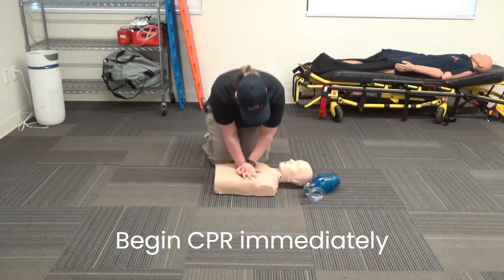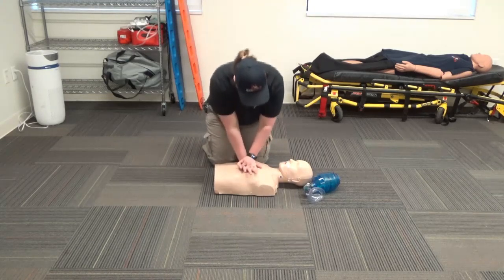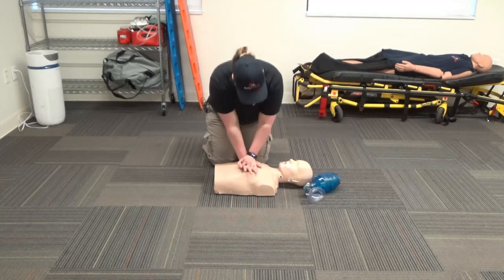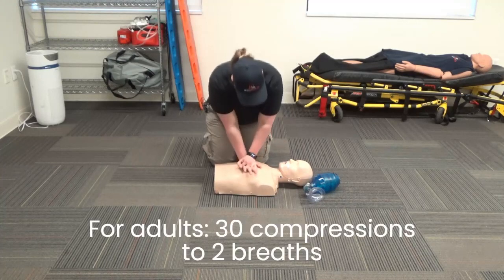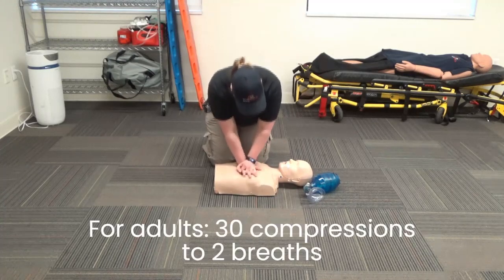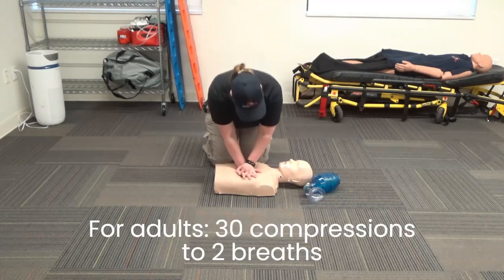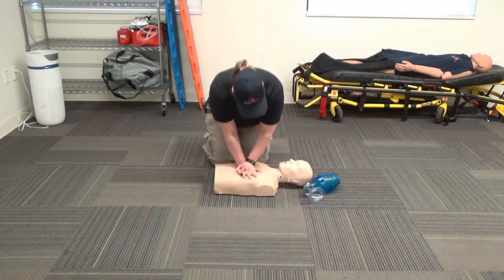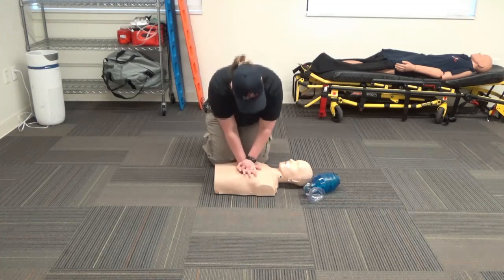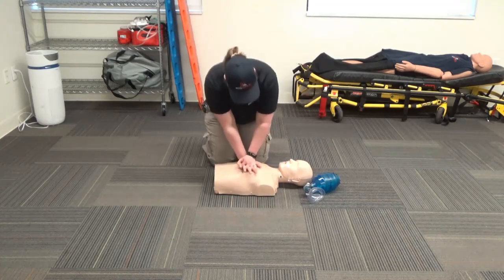Performing chest compressions, counting from 5 through 30. [Compressions: 5, 6, 7, 8, 9, 10, 11, 12, 13, 14, 15, 16, 17, 18, 19, 20, 21, 22, 23, 24, 25, 26, 27, 28, 29, 30.]